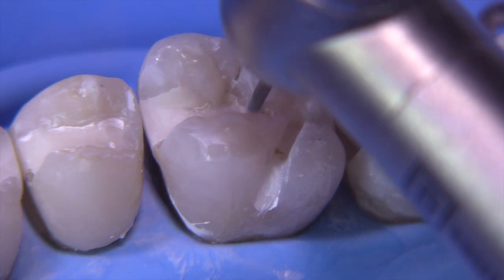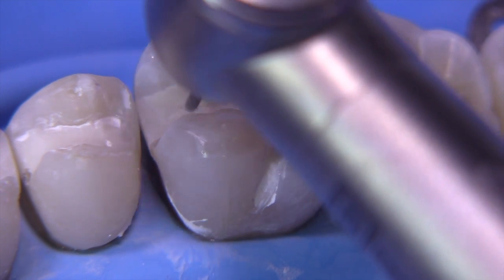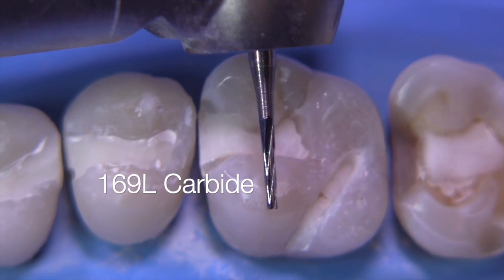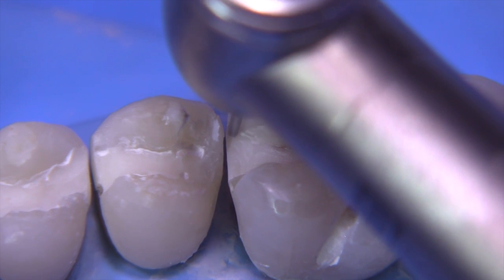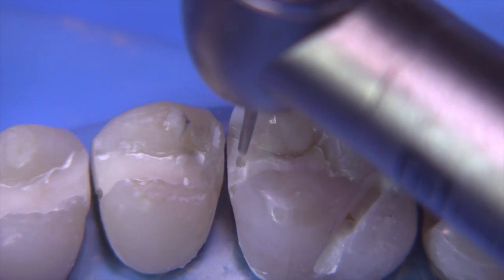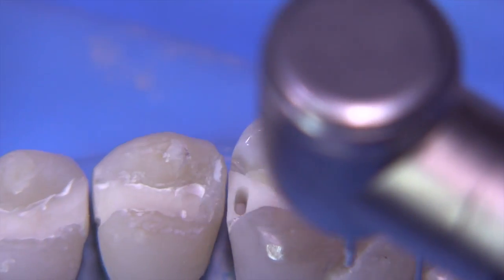Remember to tip the bur distally when working in the dovetail area, and lean the bur towards the mesial on that part of the wall and distally over here. When you go to the facial area, you'll lean it facial; on the lingual, you'll lean it lingually — so your hand is always rotating perpendicular to the wall you're preparing. With the basic outline form completed, we're now ready to start the box with the 169L carbide, getting a little more extension to achieve a nice 135-degree flare angle relative to the axial wall.